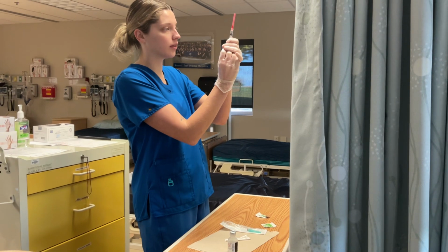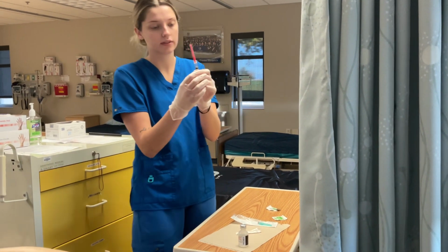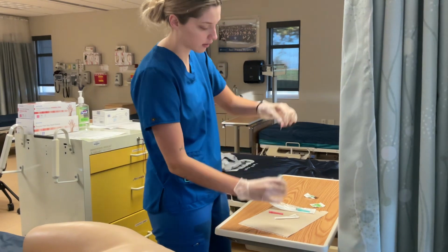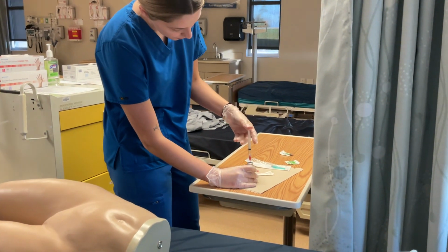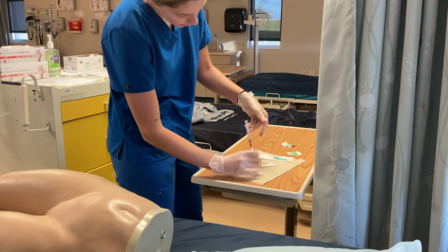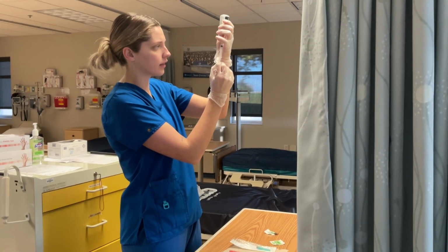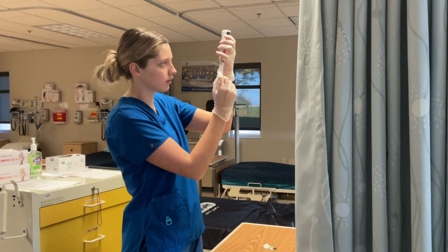Today I'm gonna do 1 milliliter because of the purpose today. I don't have someone tell me how much I need, so I will draw that back, and then I'm just gonna set that there. Stick it in my vial. Put the air in, and then I'll turn it. Make sure I have the correct amount with no air bubbles.